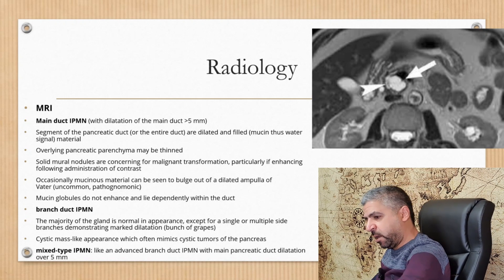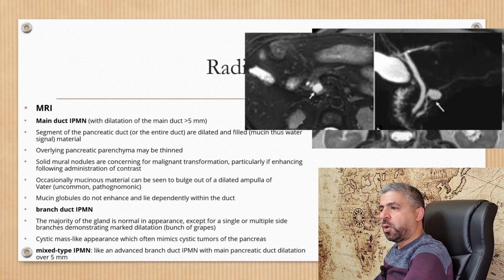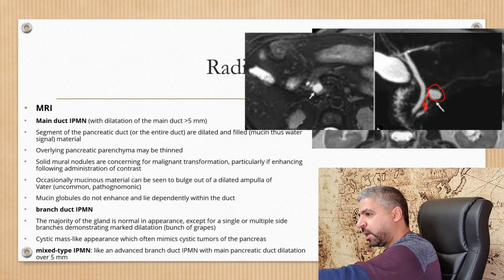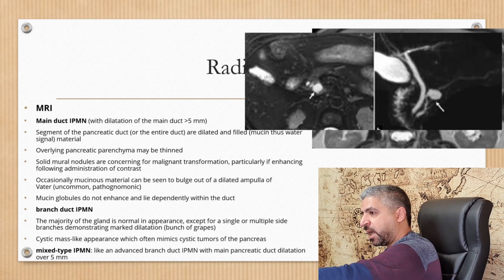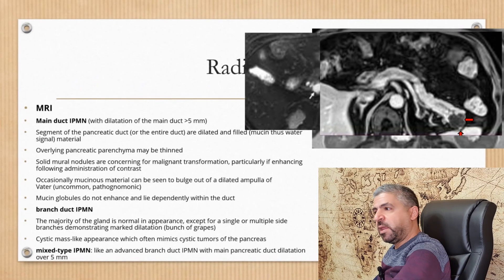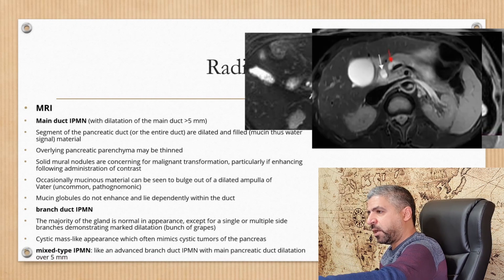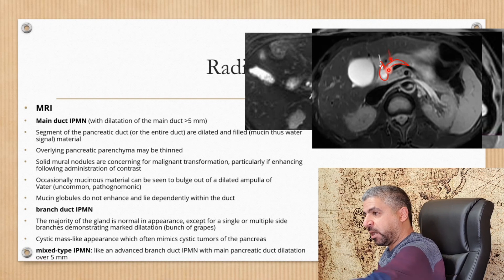On MRCP, this characteristic cystic lesion with thinning of adjacent pancreatic parenchyma is clearly connected with the main pancreatic duct, confirming IPMN. The duct is dilated more than 5 mm — this is a main duct IPMN. A main duct IPMN in the tail of the pancreas on T1 post-contrast shows a cystic lesion in the tail with thinning of the rest of the parenchyma. On T2 fat-saturated images, the main pancreatic duct is dilated more than 5 mm, suggesting IPMN.